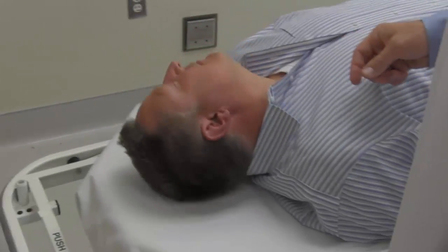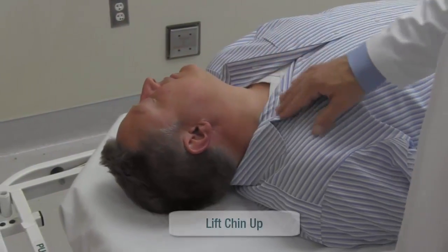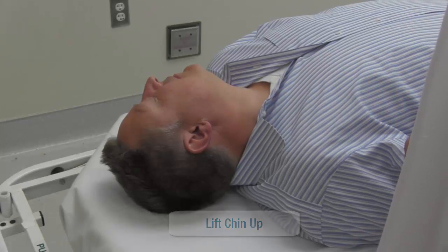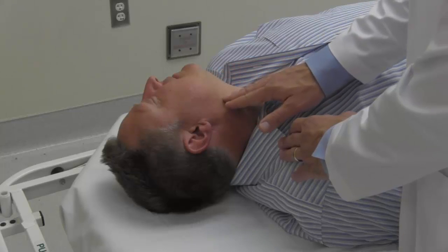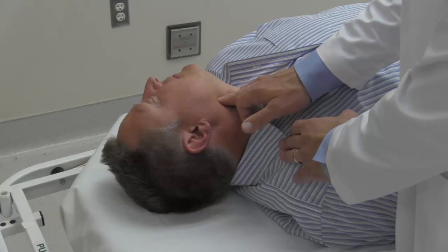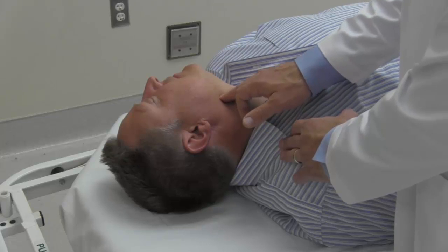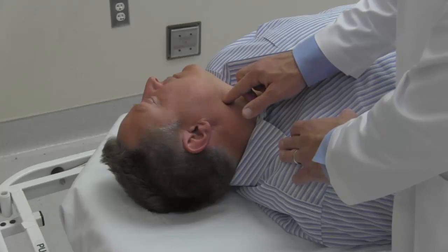To assist in identifying the carotid pulse location, it may be helpful to have the patient extend his neck by lifting his chin and slightly rotate away from the artery that is being palpated. If needed, a rolled-up towel may be placed under the patient's neck to provide support. However, it is ideal to remove any pillow from behind the patient's head.